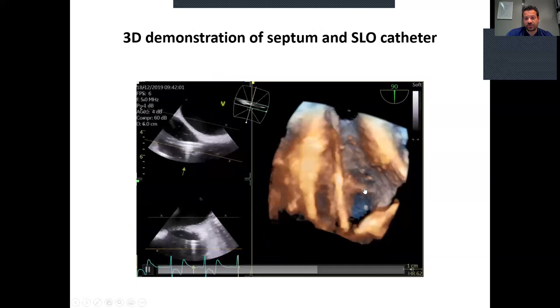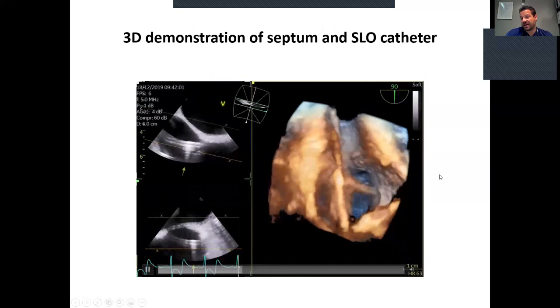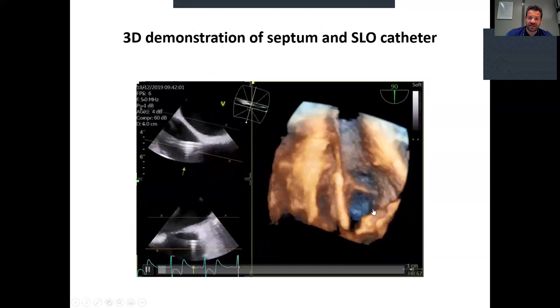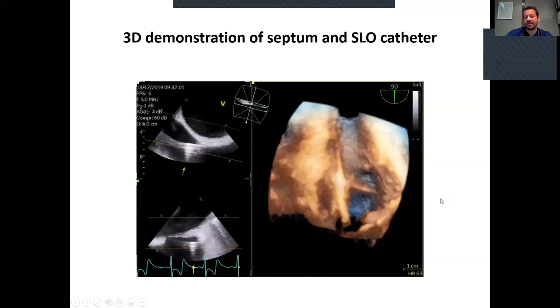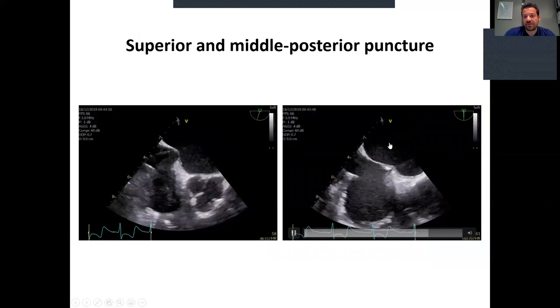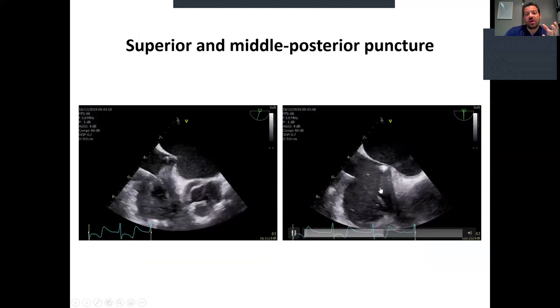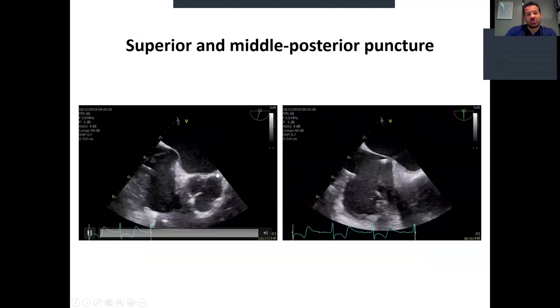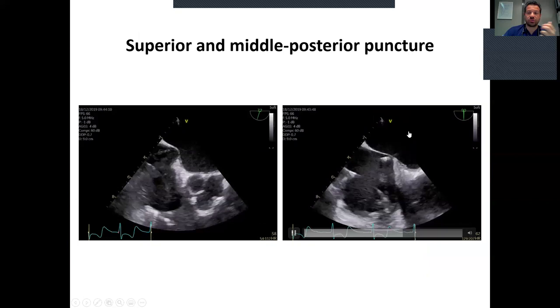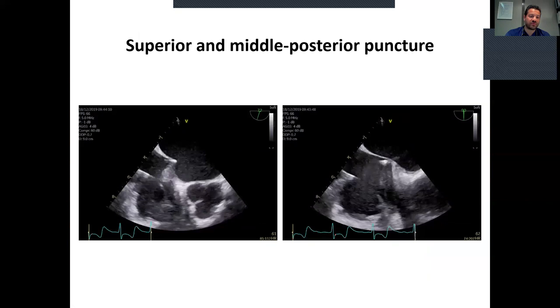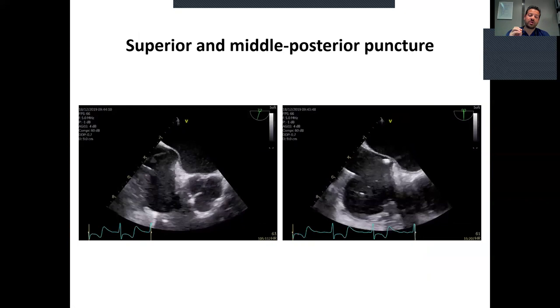When checking the right side of the septum, we place the aorta at the right side of the image and identify the superior vena cava, inferior vena cava, and fossa ovalis. We can guide our interventionist as the SL0 catheter comes down from the superior vena cava to the fossa ovalis. At the thinner part of the septum, we know we have to puncture high — superior — and at the middle or posterior part of the septum on the short axis view, to stay away from the aorta. Remember: puncture superior and middle to posterior.